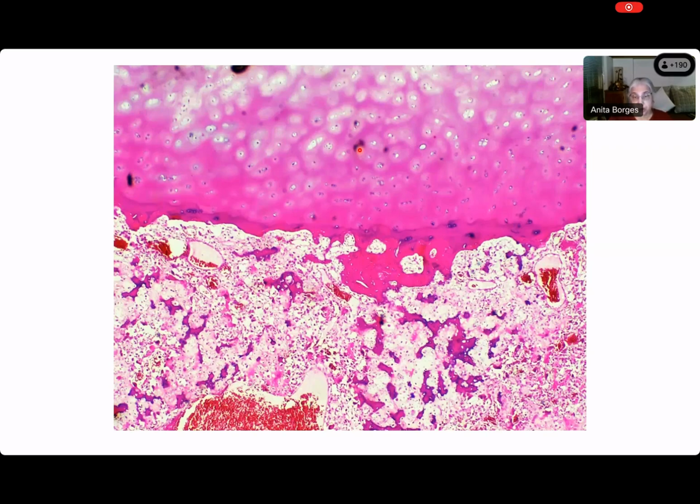decalcify something. All right, so come on now, Sarangi, you're seeing articular cartilage, which tells you that what we noticed on gross was absolutely right. There is a lesion. It is a tumor. It has reached the articular cartilage, but it has not breached the articular cartilage. And you're seeing a lot of calcified structures over here. Okay, you can see them. They are trabeculae. You can call them reams of something that is calcified.